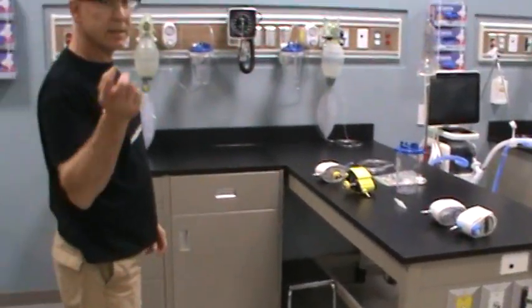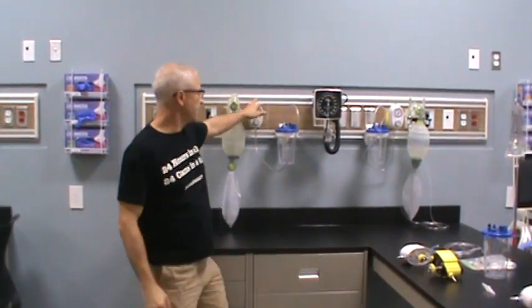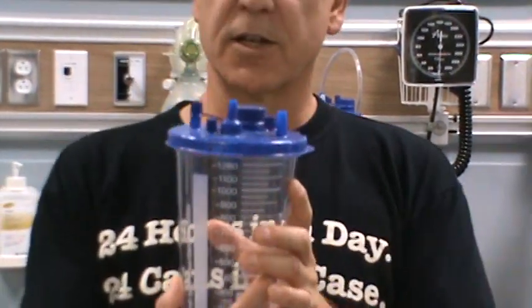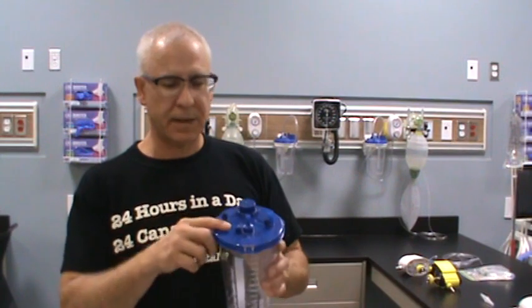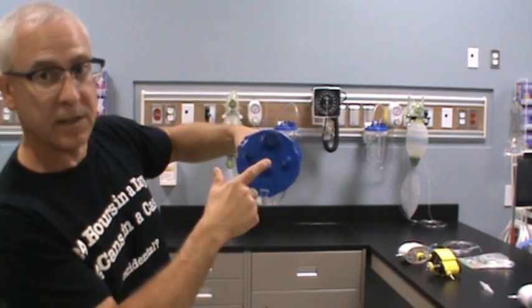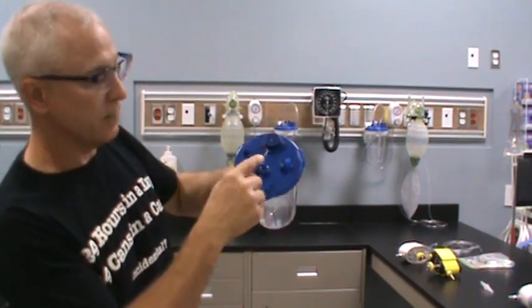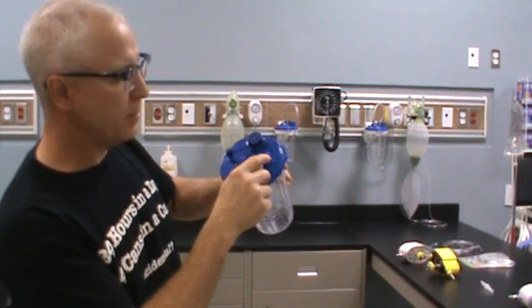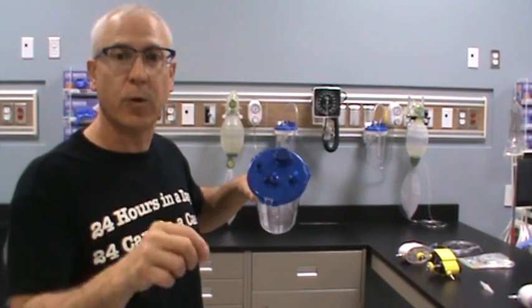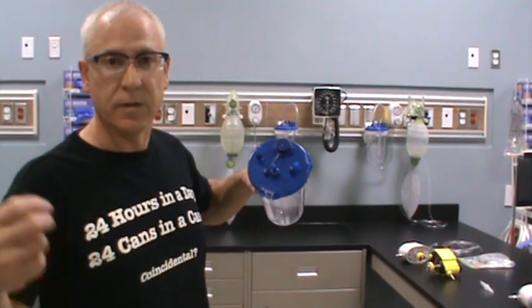Now I'm going to show you how to set the suction up. We've got our suction regulator, and we'll also need a collection unit. On top of the collection unit, there are a couple of different openings. When you set this up, you need to have it configured appropriately. You can see it says vacuum and patient. Vacuum means you hook up the tubing coming from the regulator to the vacuum port. Patient means you hook up the tubing that goes to the patient — the suction tubing — and with the suction tubing you hook up whatever apparatus you need to effectively suction your patient.